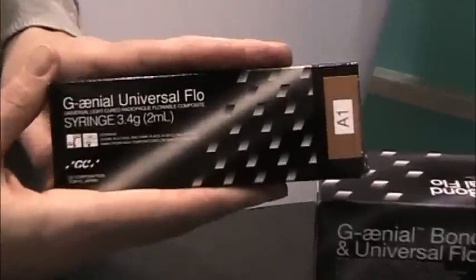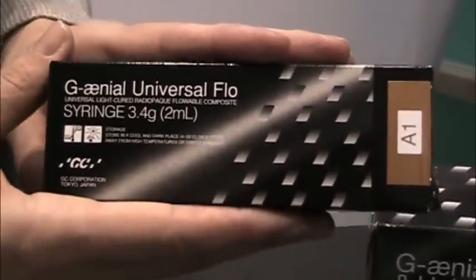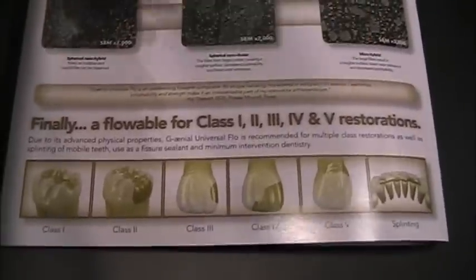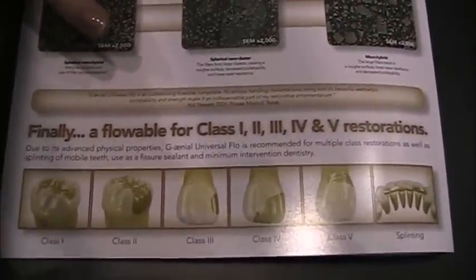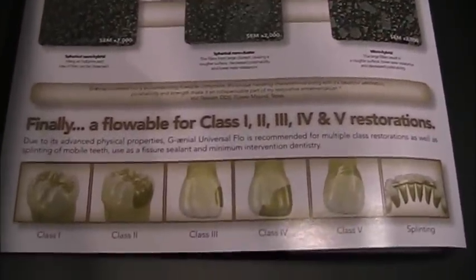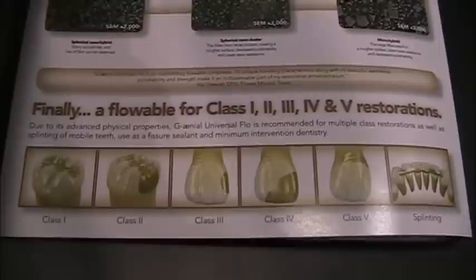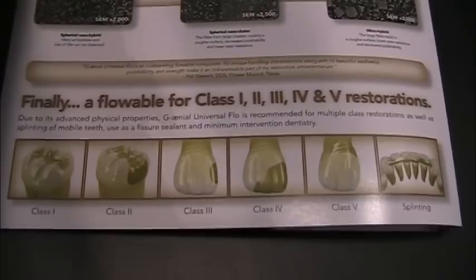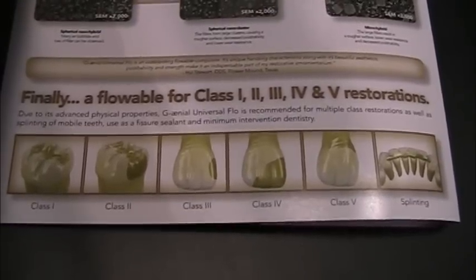This is called Genial Universal Flow. What's unique about this is that for the first time, you can actually use a flowable composite in class one, two, three, four, and five restorations — from the bottom to top in restorations. It's actually strong enough and aesthetic enough to fit all your needs. It's not a bulk fill product, so you do need to cure it in layers. However, it does have beautiful strengths, beautiful aesthetics, and excellent handling.